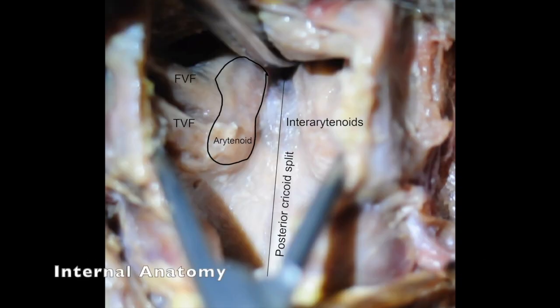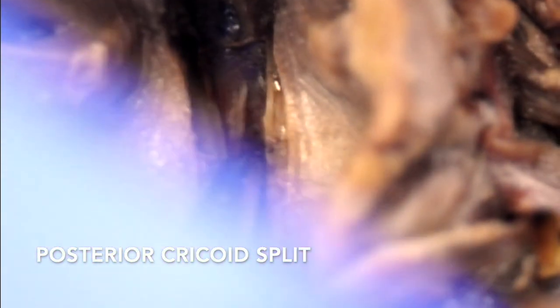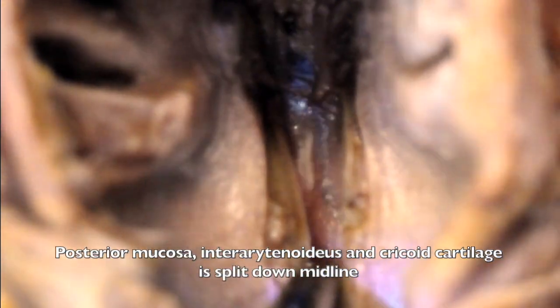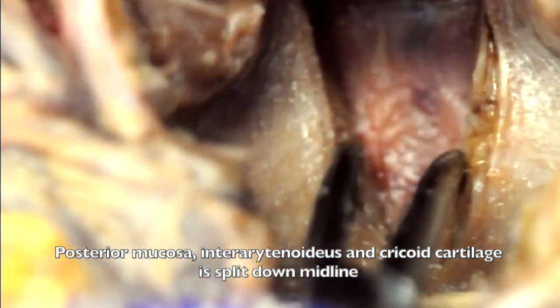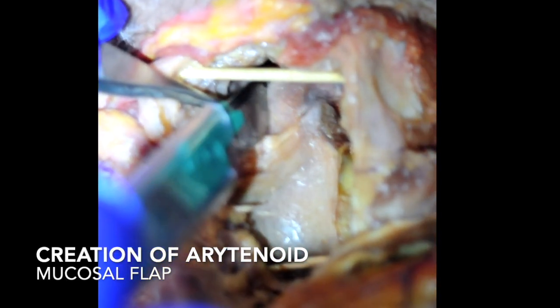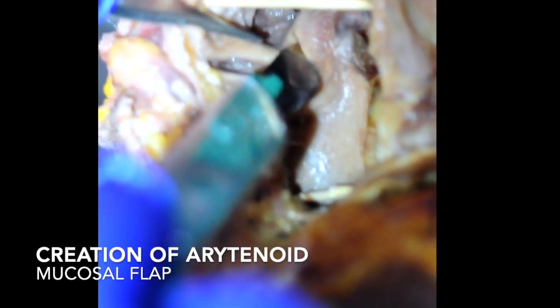The standard oscillating saw is used to perform this part of the procedure. The internal anatomy of the larynx is now shown. The posterior cricoid split has been performed through the cricoid, and we also cut through the intra-arytenoidous muscles to free the stenosis.